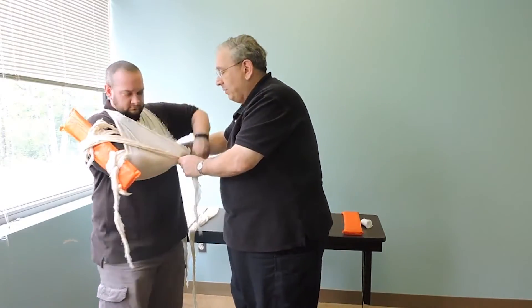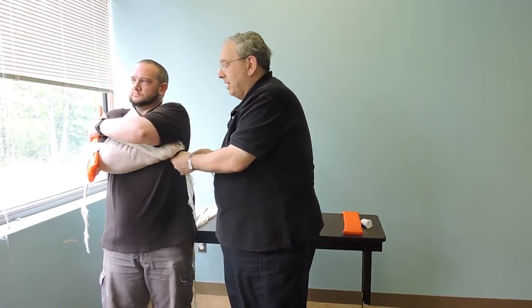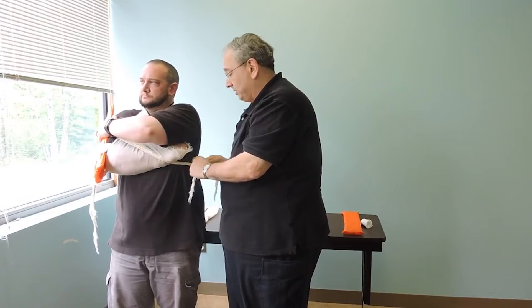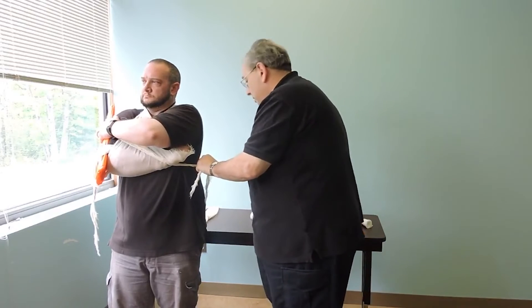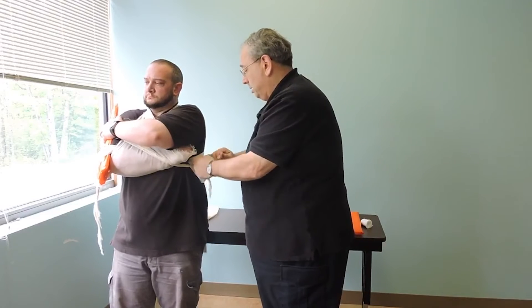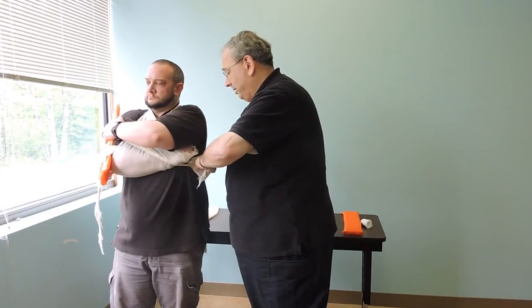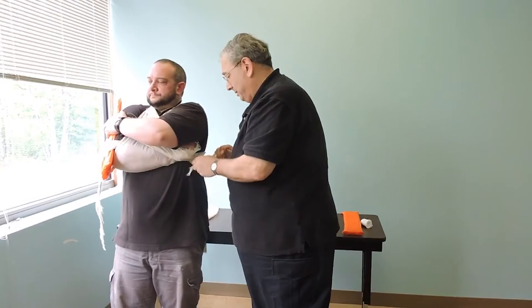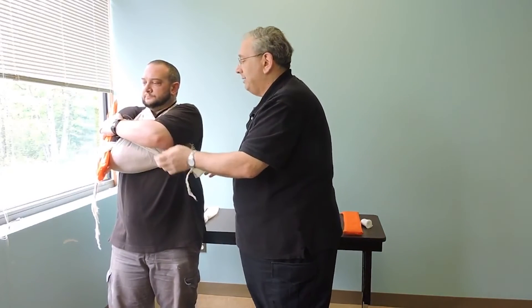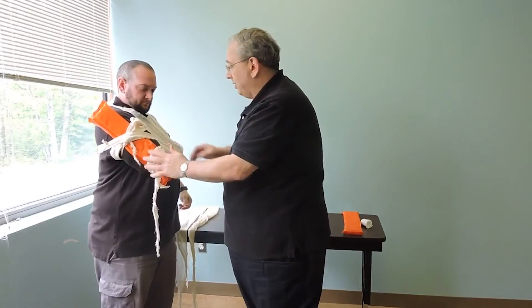I want to come in and grab the wrist to keep that arm immobile against the patient's chest. I'm going to pad, tie that surgeon's knot, have my patient inhale, tighten it, tie it, and this is secured.